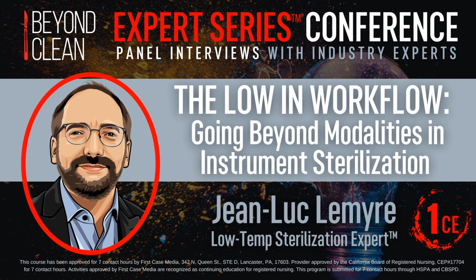Yeah. And just to provide a bit more detail about how it can impact low temp sterilization. If you've got residual chemical on your device or even on your packaging when it goes into the low temp sterilizer, because the dosage was wrong or because a rinsing condition was not correctly done, some of these chemicals can interact with the peroxide. And if it reacts with it, the peroxide is no longer available to do its job for sterile efficacy. So that's one obvious way.